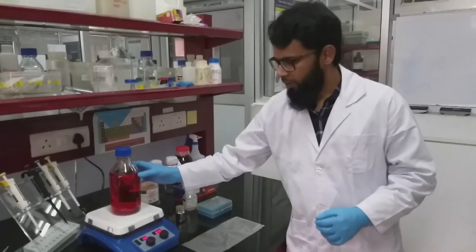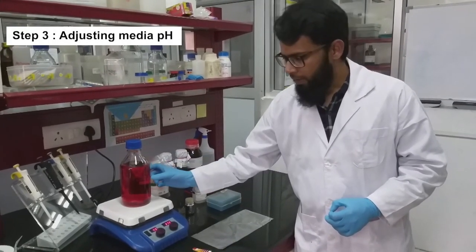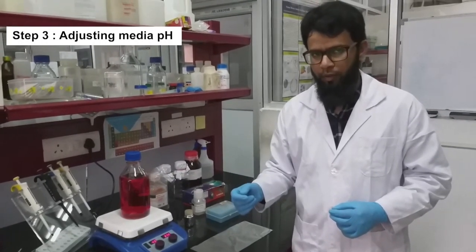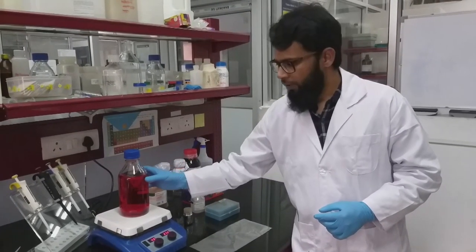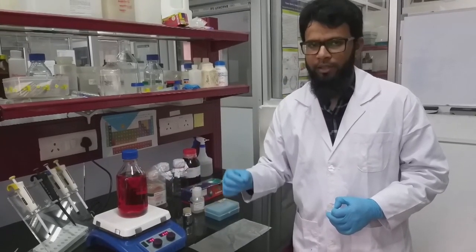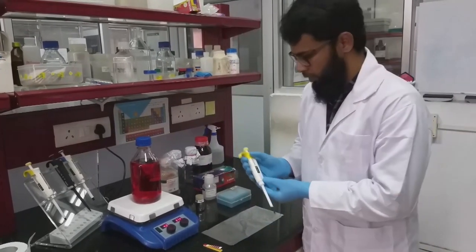After the components of the media have been dissolved completely, we now need to adjust the pH of the media. The bright red color indicates that the pH of the media is in the range of 7.2 to 7.4. If the color of the media turns purple, then it indicates that the media is basic. If the color turns yellow, then it indicates that the media has become acidic. Now we'll be checking whether our media falls in the range of 7.2 to 7.4.